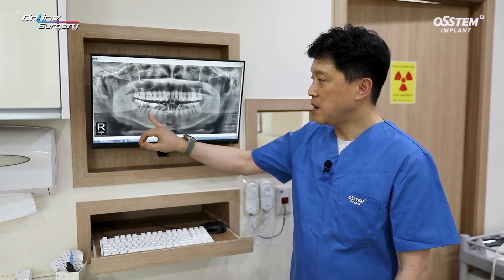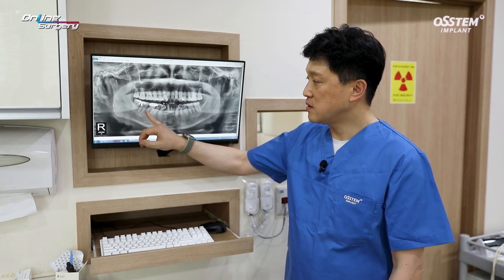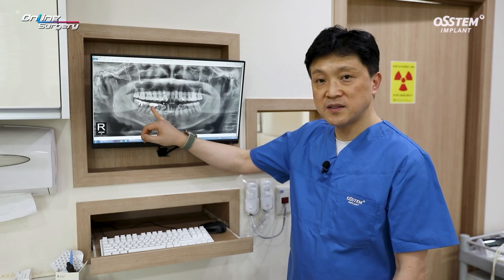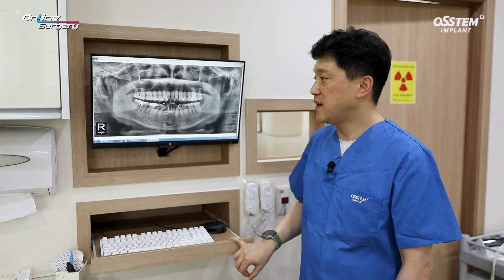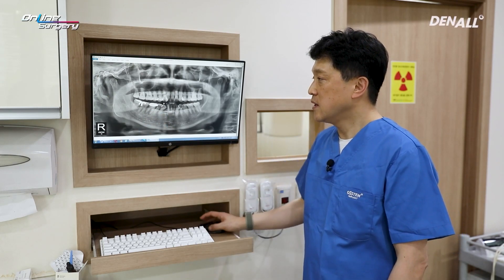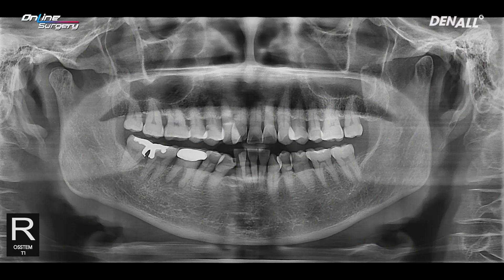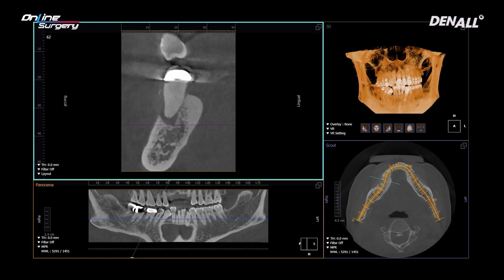This is the surgical clip of the day. As you can see in tooth number 46, there is a periapical lesion and furcation involvement. This tooth required extraction. If you look at the panoramic image, there is a periapical lesion in the distal root and it has been extended to the furcation.